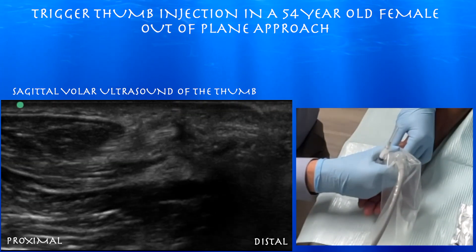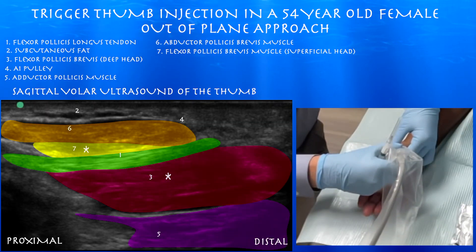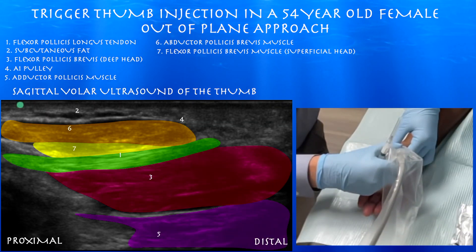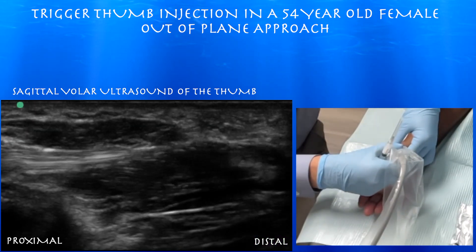You can appreciate the abductor pollicis brevis muscle on top. The flexor pollicis brevis muscle kind of wraps around and underneath the flexor pollicis longus tendon. And then you have the adductor pollicis muscle underneath that.